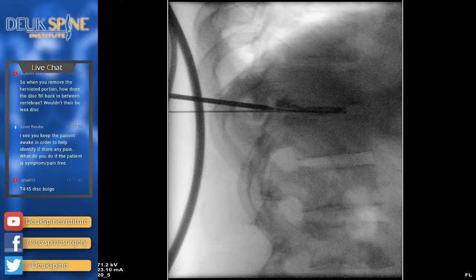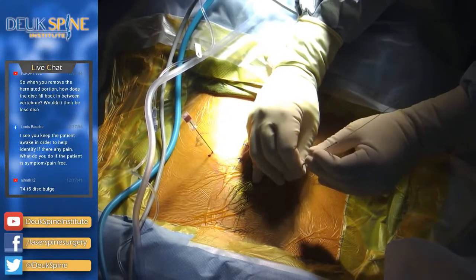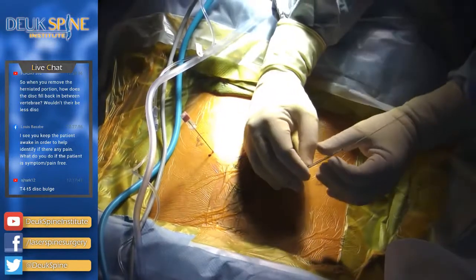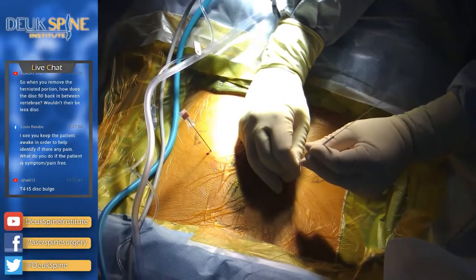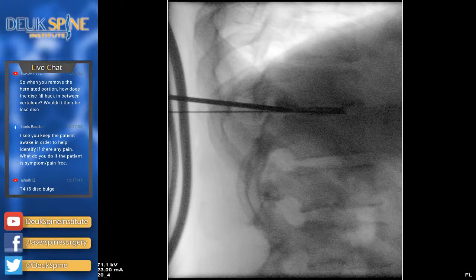But boy, there's a herniation here. I can feel it. All right. Pushing through it. Actually reducing it back into the disc space. I'm using my fingers, and I'm controlling the movement as much as I can to be safe for the patient. I'm inside the tear of the disc at this point, just starting to go in the disc.